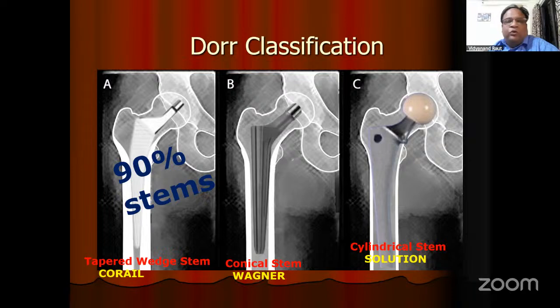You are happy with that. You should be reasonably happy with the trial. The actual stability which you are going to get with the final cup will be much better, because the final cup is generally half a millimeter bigger, with the porous coating. So you are going to get a good stability.